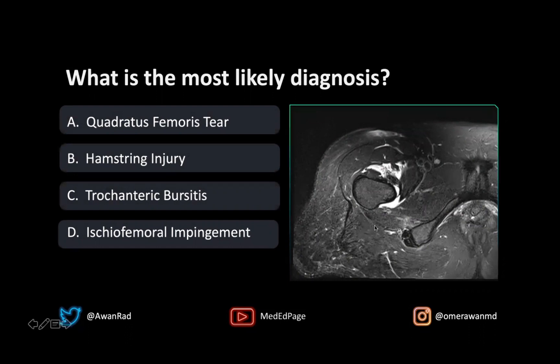If you take a look here, this is the femur, and this is the lesser trochanter. This is the inferior pubic ramus. These two tendons are the hamstring tendons — the more anterolateral one is the semimembranosus, and the more posteromedial one is the conjoint tendon of the semitendinosus and biceps femoris. We have a little bit of fluid in the joint capsule. The dominant finding is intramuscular edema within the quadratus femoris muscle.